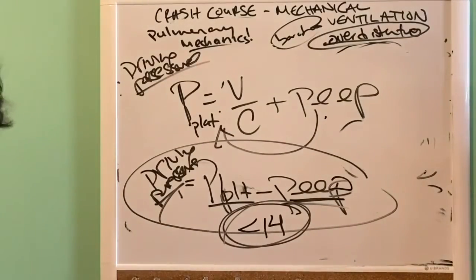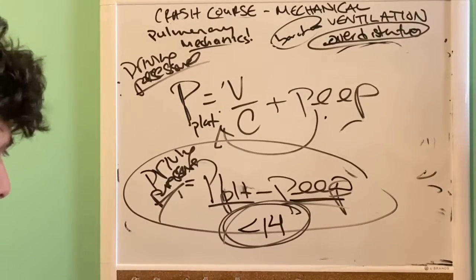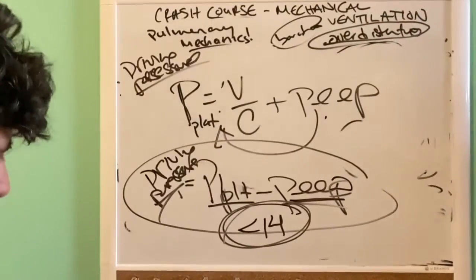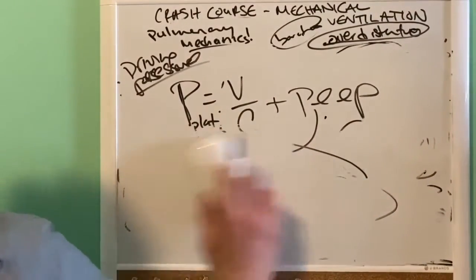So we're going to try to figure out how to separate the H and the L types. Of course, these high compliance, low elastance L types, nearly everyone put on the ventilator, unless they were on non-invasive CPAP, are going to be an L type from what I've seen. So the driving pressure is perhaps something we should follow.